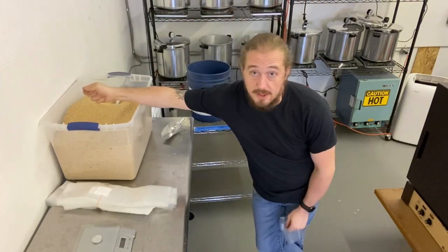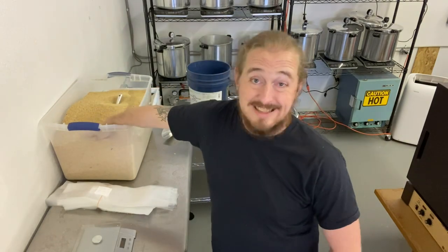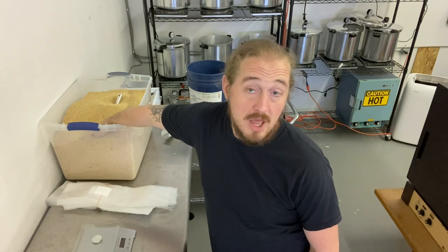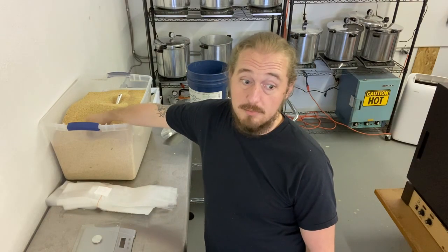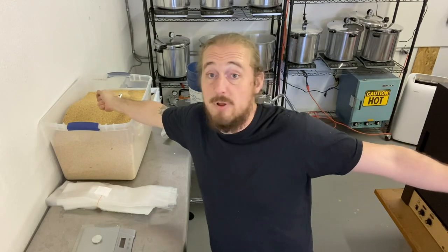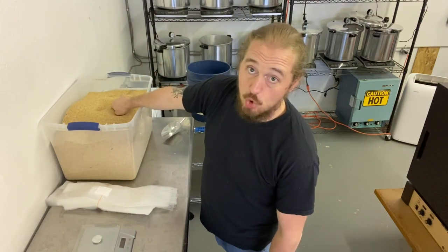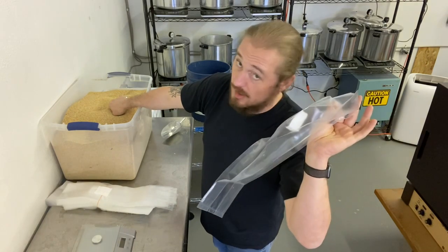This is whole white millet, poured into a tub. I have not rinsed it, cleaned it, soaked it - nothing. This is literally pour-it-in-the-bag filthy millet. The reason why is it doesn't matter if it's dirty, it doesn't matter if there are floaters - mycelium does not care. You're going to grab a scoop and put 1,000 grams of whole white millet into this bag. A little bit over is okay.